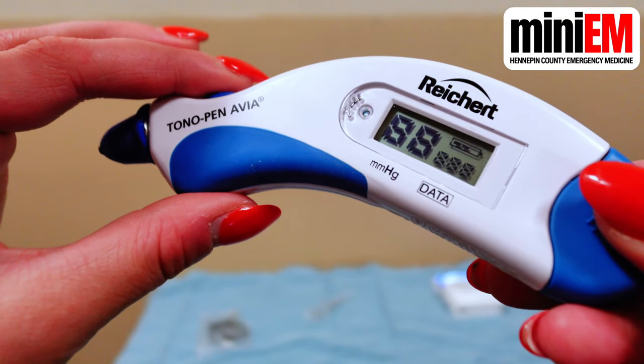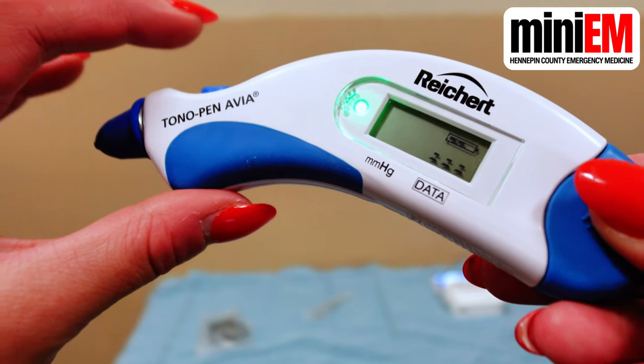Take your tono pen and press the blue button on the top of the pen to turn it on. After a few seconds, it will beep and the light will turn green.